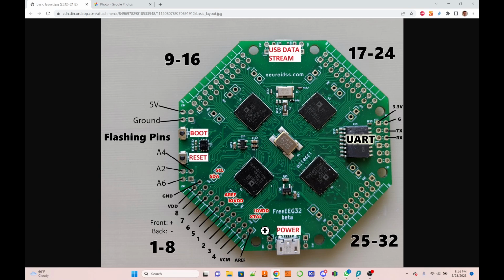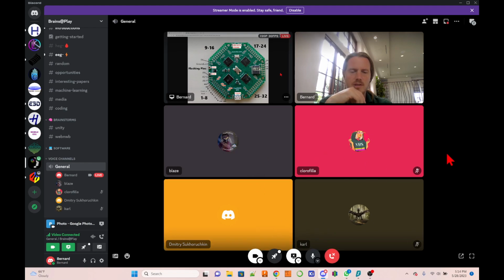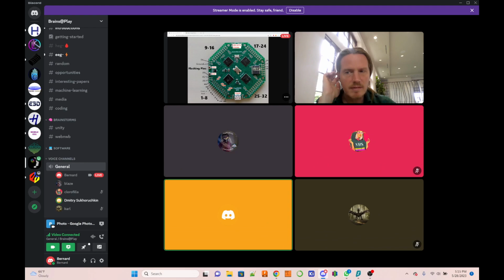So the idea was to copy Cyton, but this ADC chip provides channels this way. So I'm not making vias in the board to make it different. I made it without, so as to provide the output of the ADC directly with minimal vias or anything that can create noise. I think this is why the numbering looks so. Yeah, the numbering comes out of the ADC that way.